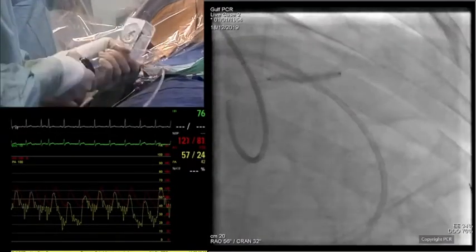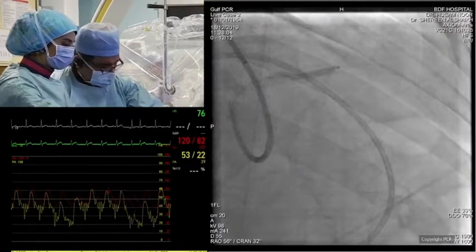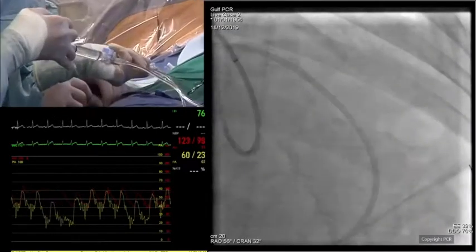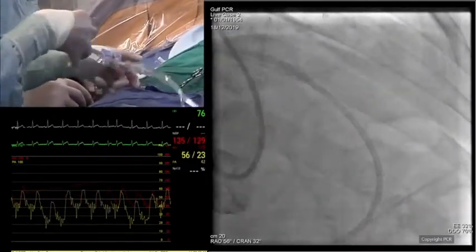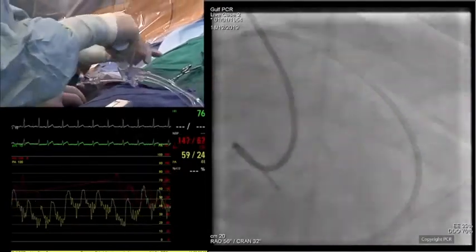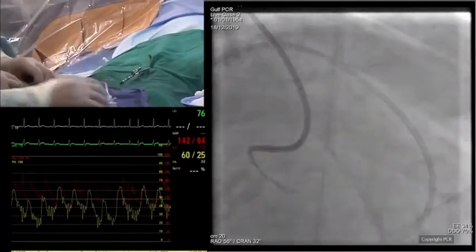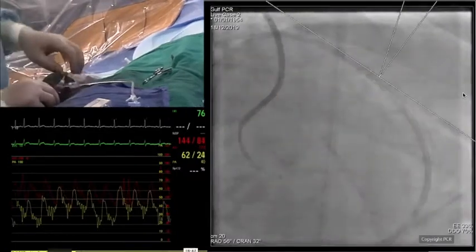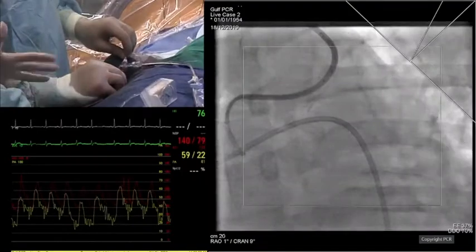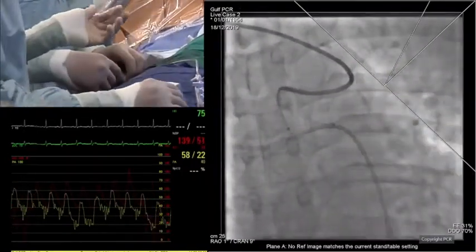Hadi, Hussam and Shane, it's a beautiful illustration of dedication to doing imaging before these cases. Actually, what the imaging contributed to is safety even for the patient, because this is the only remaining vessel, and rotablating it, though a small hazard, if distal embolization and no reflow happened, it would have been hazardous. So it helped us out, putting in a high pressure non-compliant balloon so that we can do the procedure. The guide came out.